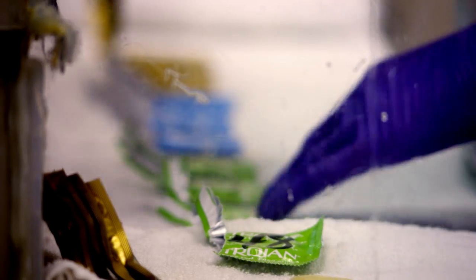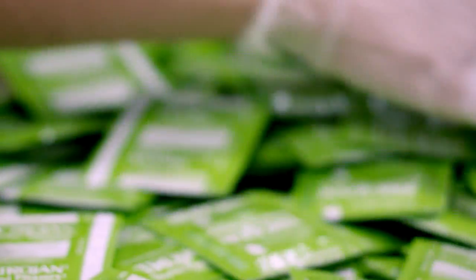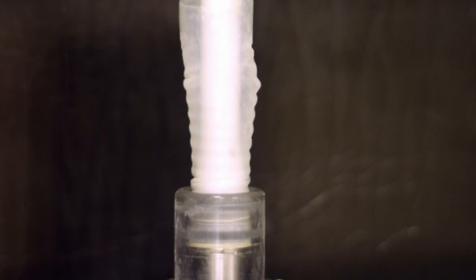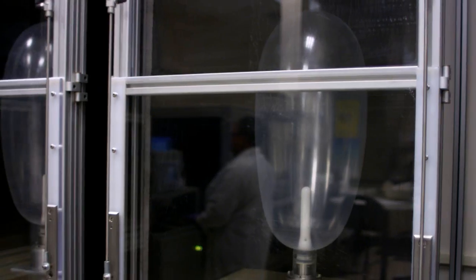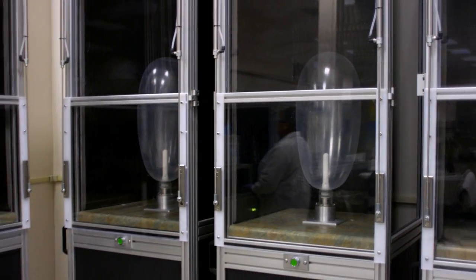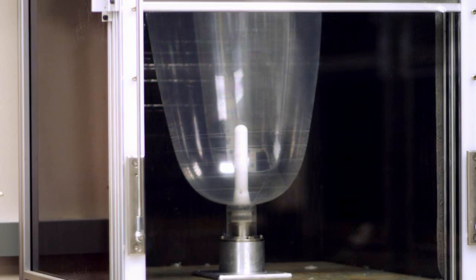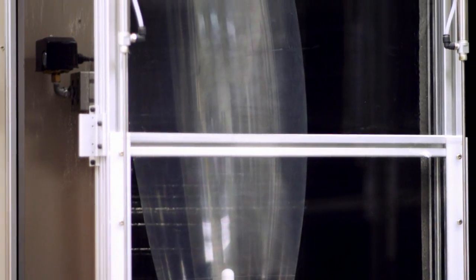This batch here is being opened from the foil and tested. One of the coolest tests is the air inflation test, where the condoms are inflated to test for elasticity and strength. These condoms here can typically handle being inflated at 25 liters of air per minute. That's greater than the amount of air it would take to inflate a basketball.